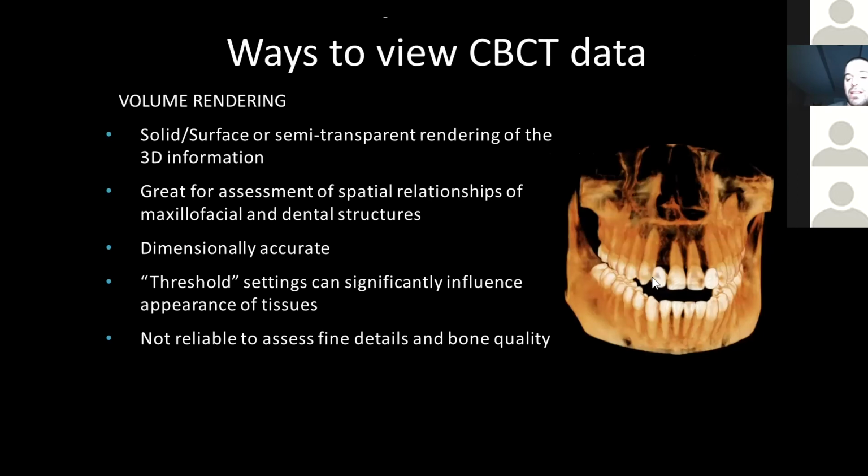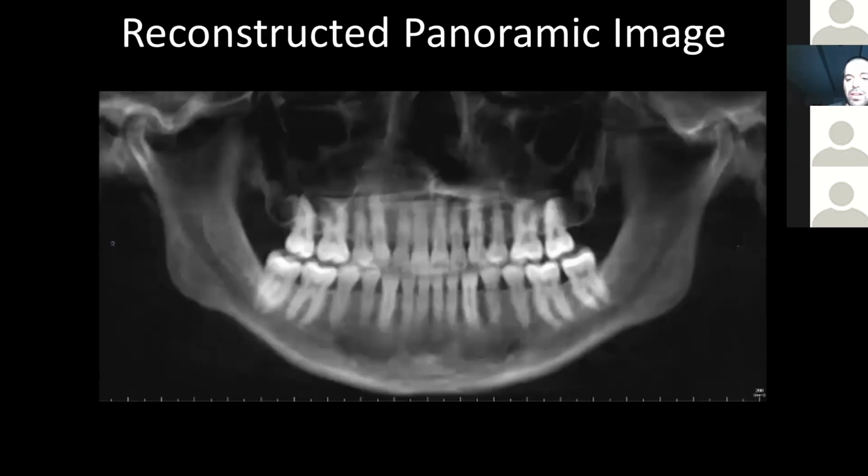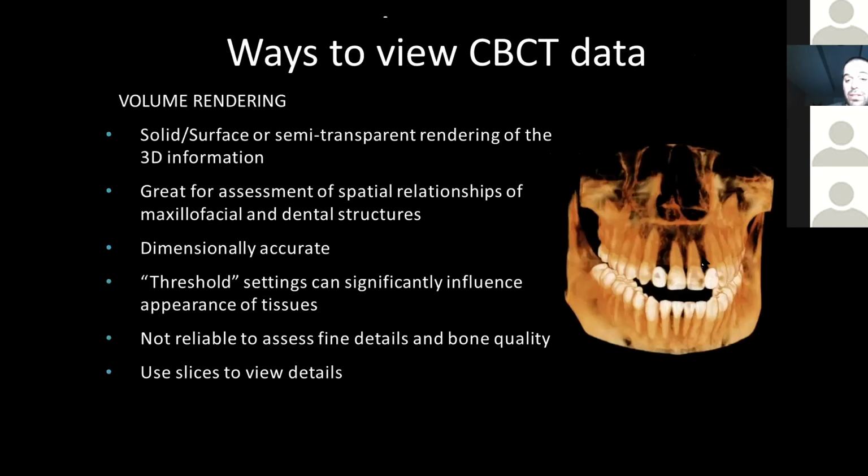This was a scan taken with a radiographic guide. So the patient was wearing essentially a flipper or interim partial with 2 radiopaque pontic or stent teeth. And the whole intent, do I have that slide? I don't think I have slices for it, but what you can do if you're doing an implant planning, which this patient was set up for, is reconstruct the slices or the pan and cut right through these edentulous 7 and 10 sites and see on the imaging exactly where you wanted that tooth. So this is basically a virtual wax up, and then you can relate surgically where you want to put that implant to the desired prosthetic goal, which is where the tooth needs to go.